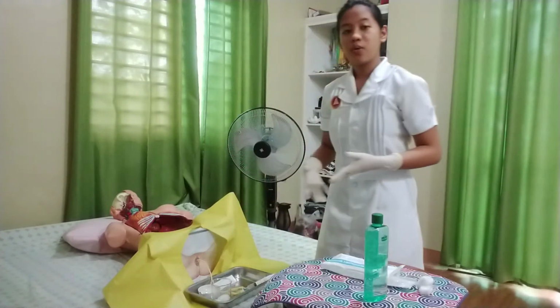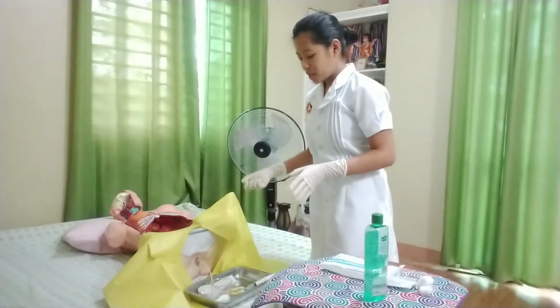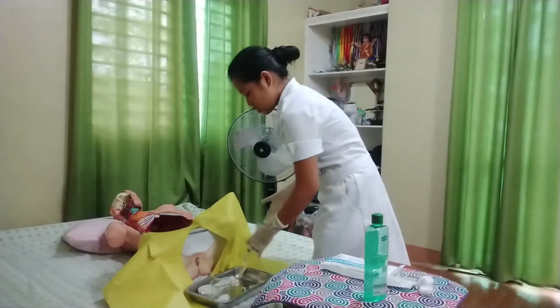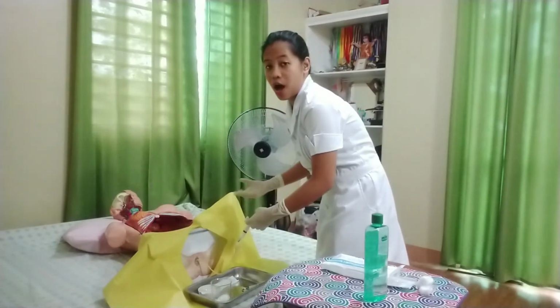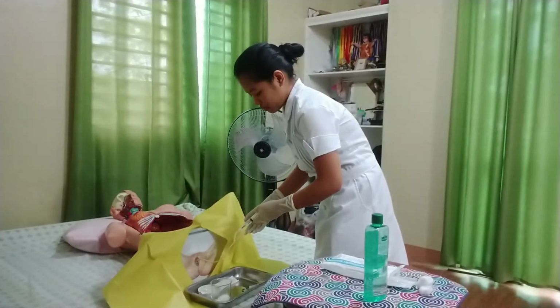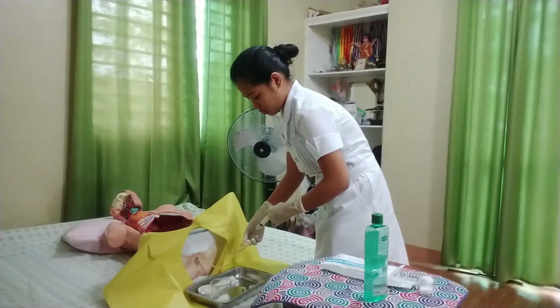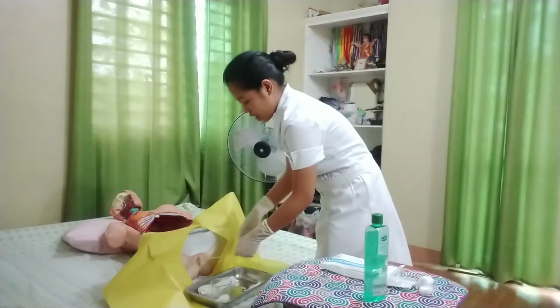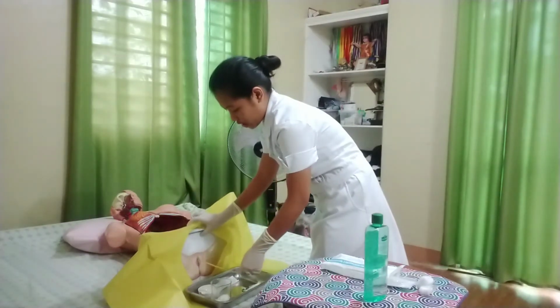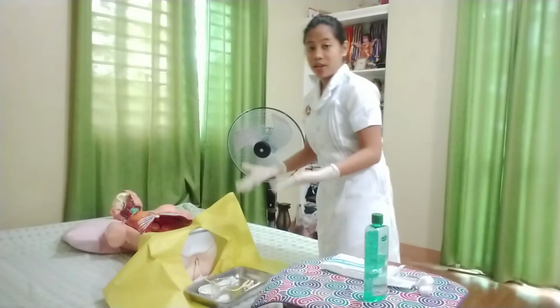Now that it is done, we will inflate the balloon of the catheter based on the manufacturer's recommendation, usually 5 ml. So we will inflate it. Then we will remove the syringe and we will tug the catheter gently to feel the resistance. So it is already good.